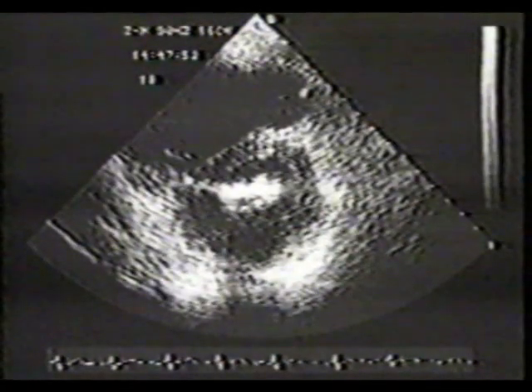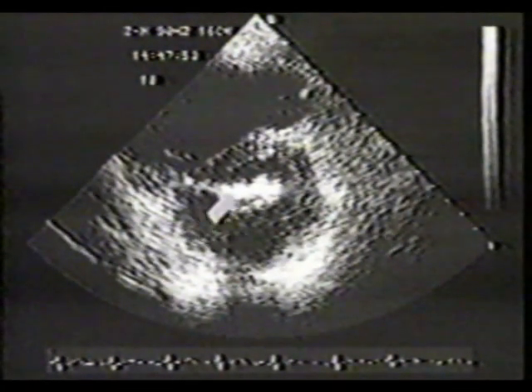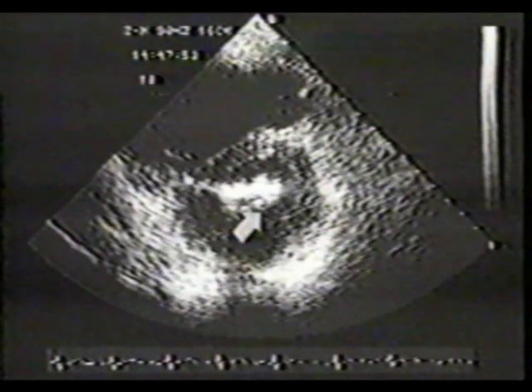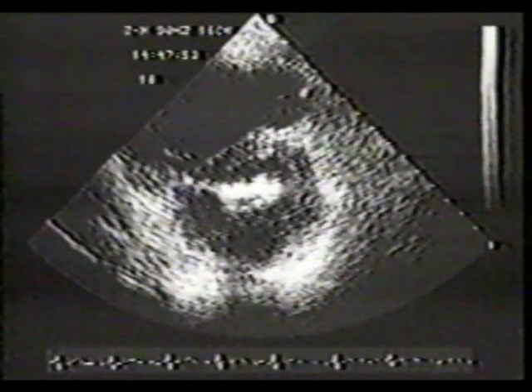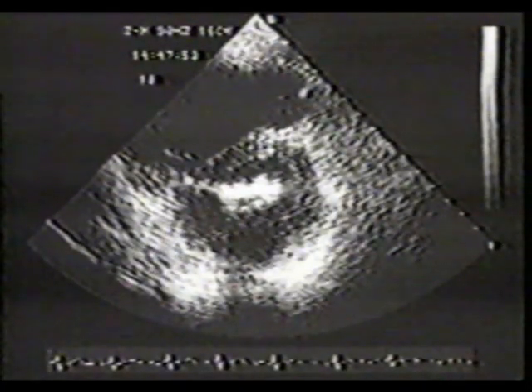In this parasternal short axis image, both the anterior and posterior mitral leaflets are thickened and calcified. Short axis scanning will be performed in an attempt to identify the minimum orifice, but the orifice is not adequately visualized for tracing.